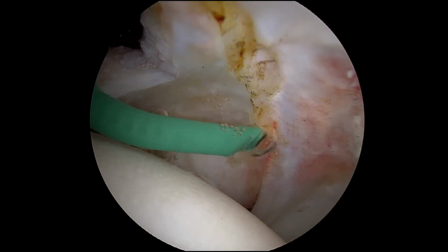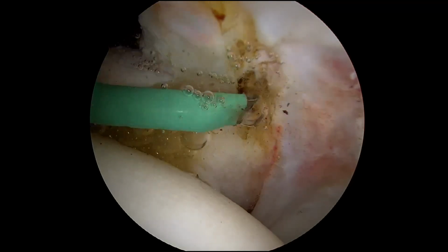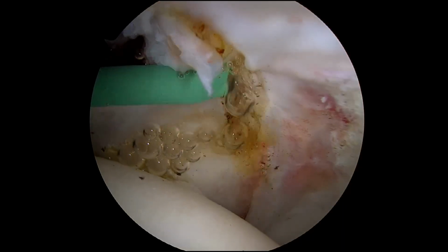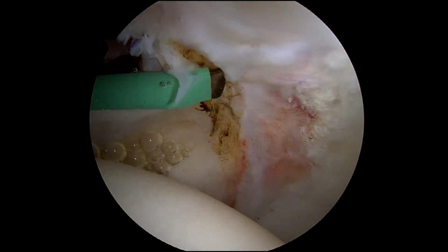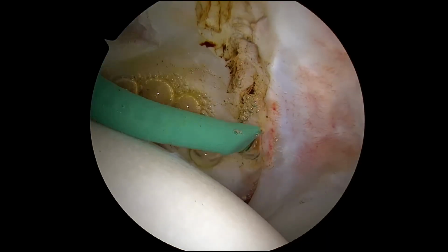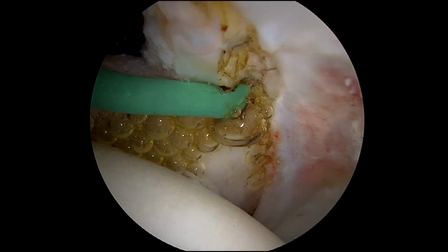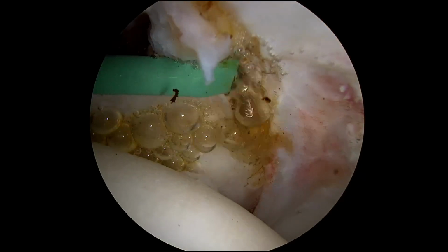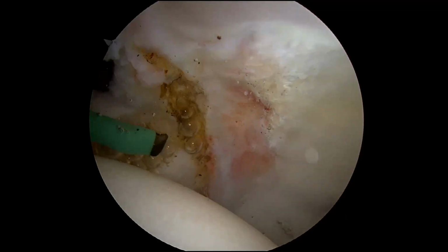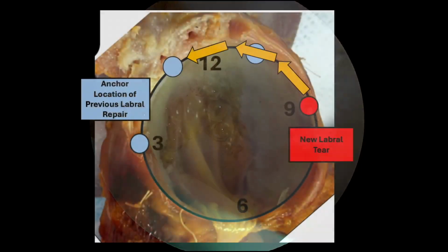adhesion. Next, a radiofrequency probe was inserted into the hip joint and utilized to separate the capsule from the labrum. It is important to accurately identify and develop the capsulolabral interval to ensure adequate removal of the adhesion. This allows for 1. Labral refixation when indicated, and 2. Appropriate capsular excursion for subsequent repair or reconstruction without damaging the nearby native labral tissue.